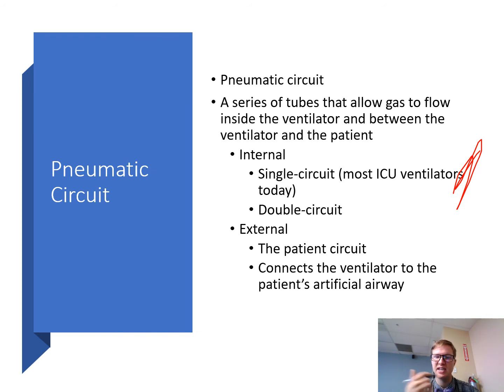In other words, if they see a leak in the system, they're going to alarm and say, hey, there's a leak in the system, or hey, there's excessive pressure in the system, right? So they have closed loop elements of logic in their control system. Once again, most commercially available intensive care ventilators are single circuit, microprocessor controlled, positive pressure ventilators with closed loop elements of logic in their control systems. It doesn't mean that they'll adjust absolutely everything directly with the patient, but they may just go ahead and alarm, or they may terminate a breath if there's too much pressure, right? Things like that can easily happen.